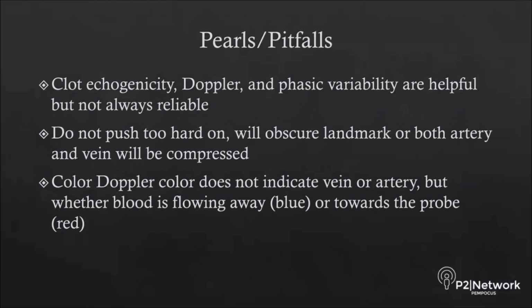I would not press too hard on the areas of interest, because you may obscure the landmark and you may actually end up pressing both the artery as well as the vein too hard. For color Doppler, the color does not indicate if it's a vein or an artery, but whether blood is flowing away, which is blue, or towards the probe, which is red.